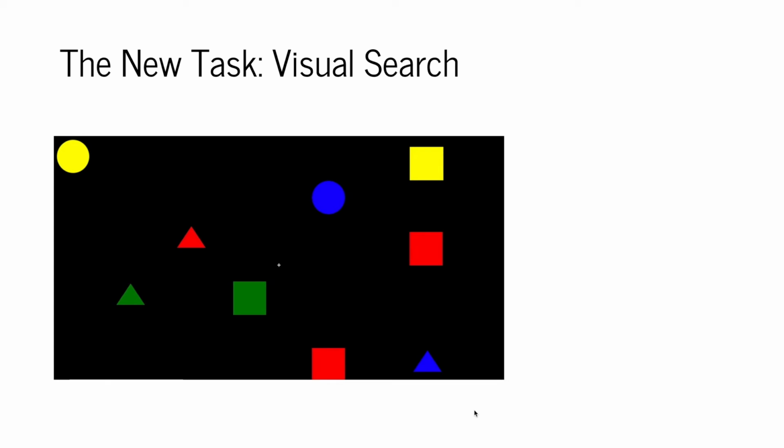Introducing the new attentive state calibration task that my project proposes, which is based off visual search. At a glance, you can see that the stimuli are colorful and varied. Furthermore, the stimuli are all over the screen, creating a lot of on-screen activity. Finally, the design features a variable difficulty to ensure that the activity does not become stagnant.